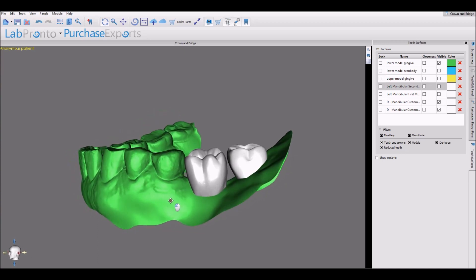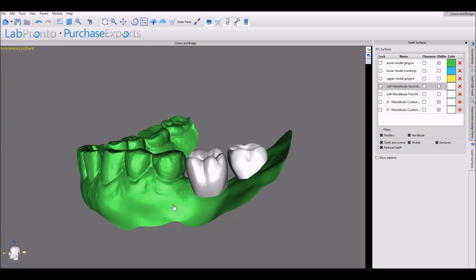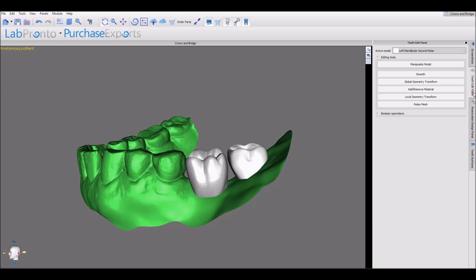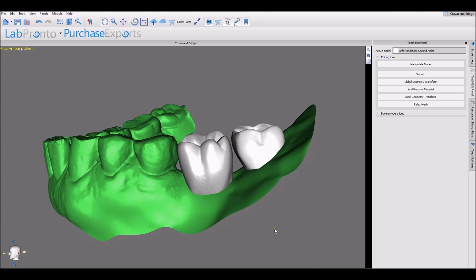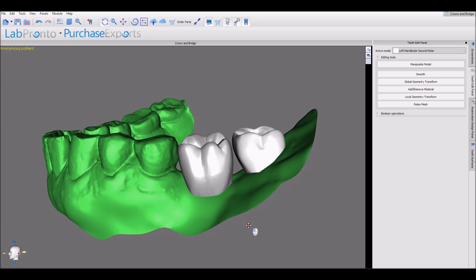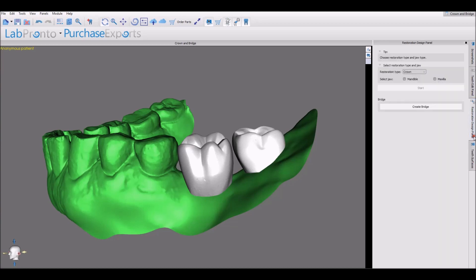The software has two ways of creating a bridge. The first is if the user is using the design tools to modify the crowns so that they'd be touching, then the software will simply create a union to combine the teeth into one surface, one STL file. The second option is as we have here, where the teeth are not touching, and we're going to go ahead and design the bridge.